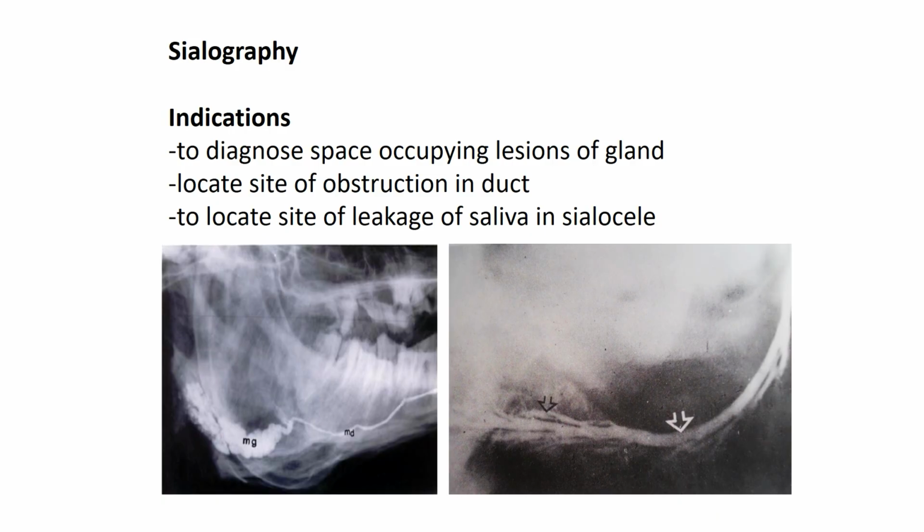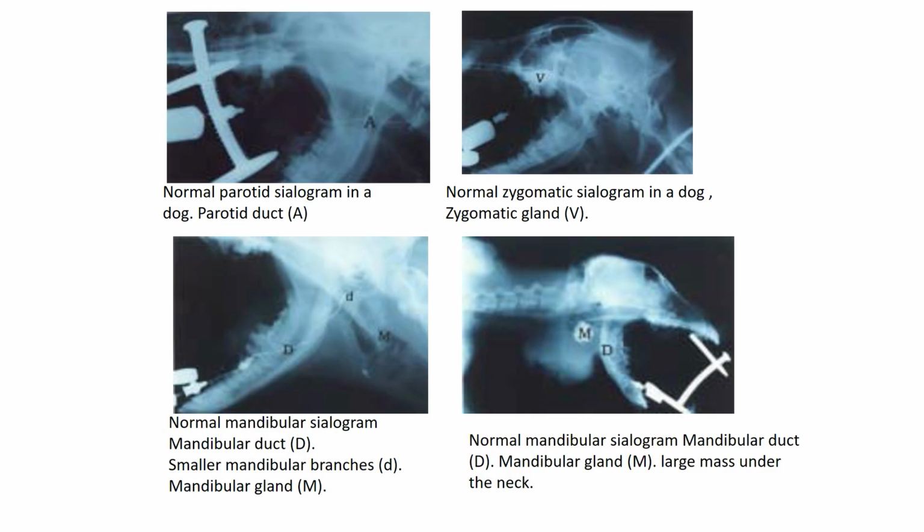After injecting this, you have to take a radiograph of the skull or salivary gland.